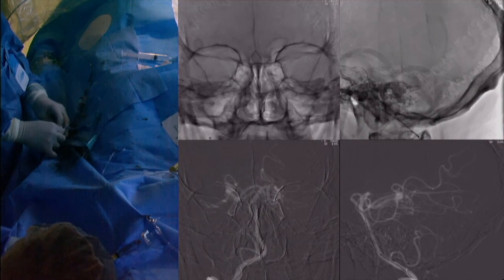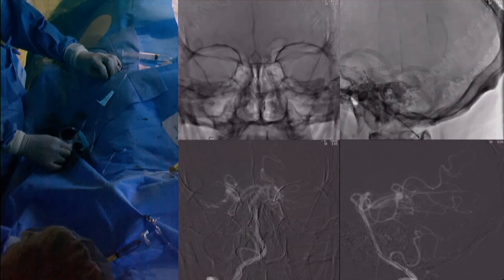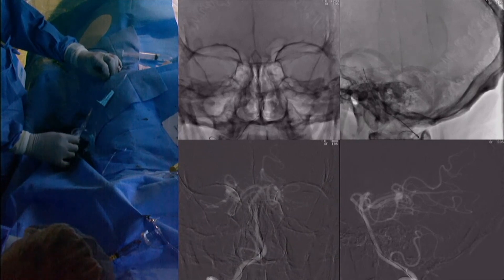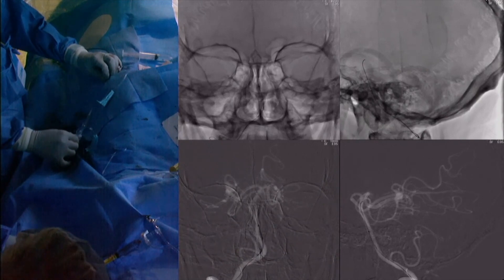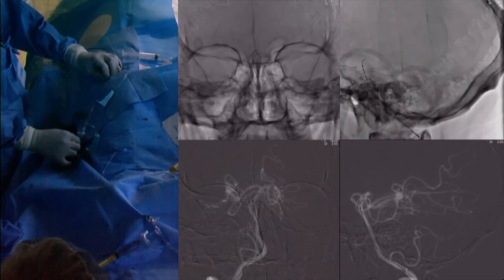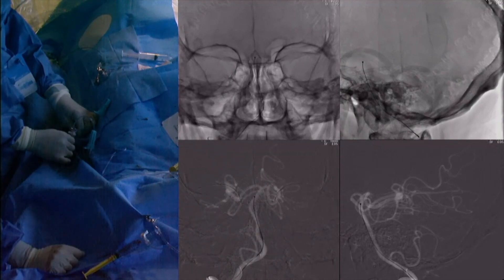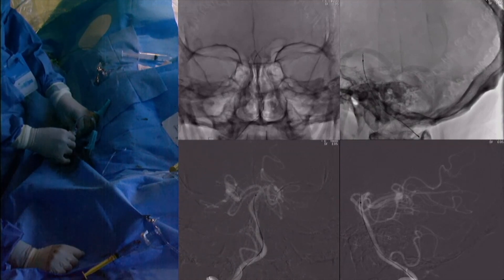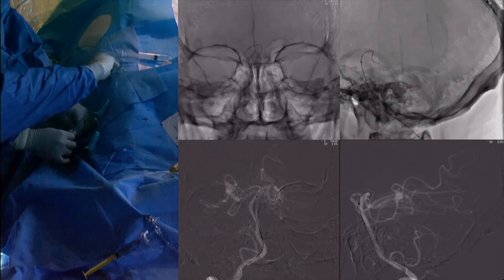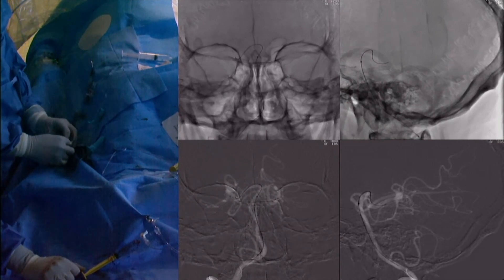We can see the anatomy is somewhat tortuous and the wire prefers to take a superior cerebellar artery. After a few attempts, we navigate the wire into what we believe to be the posterior cerebral artery. However, the wire doesn't quite match the road map.